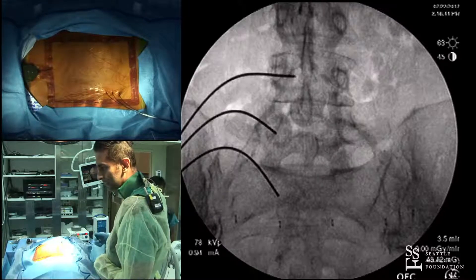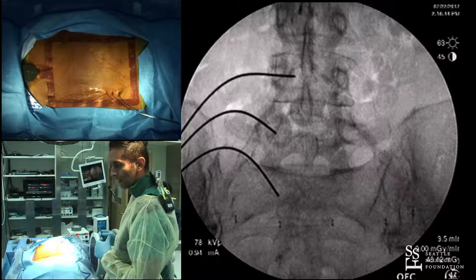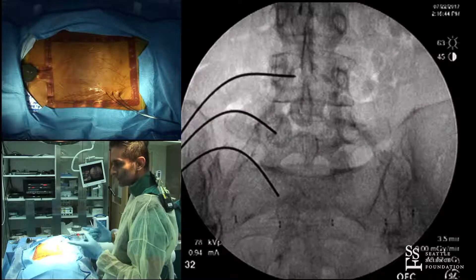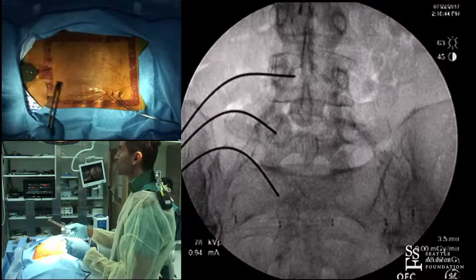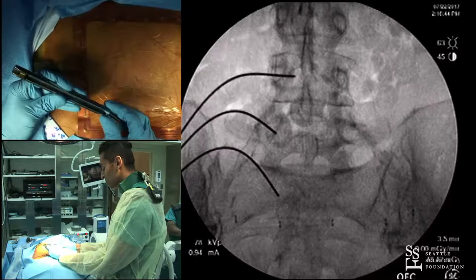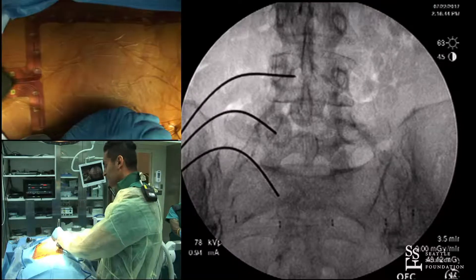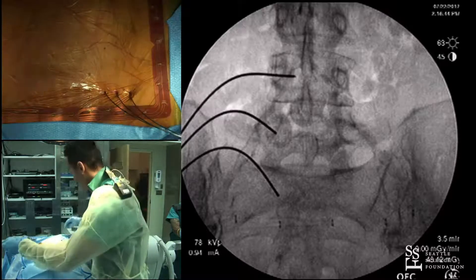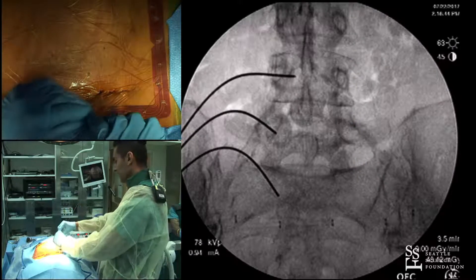We're using a Pathfinder NXT here — it's an older system, for disclosure purposes. I'm redesigning the Zimmer MIS system, the Vitality MIS, which will replace Pathfinder. Pathfinder was great for reduction — a very solid tower — but it's a closed shaft screw, making it somewhat more challenging. It's one of the most robust systems with great fixation to the tulip, good for derotation maneuvers and rod reduction, though a little less so when screws converge.